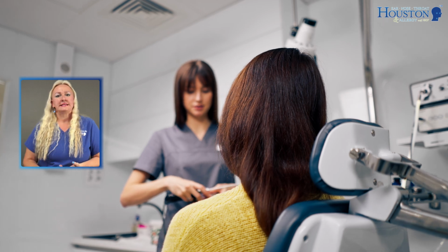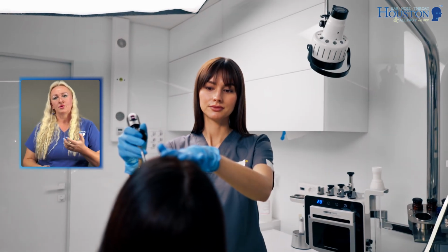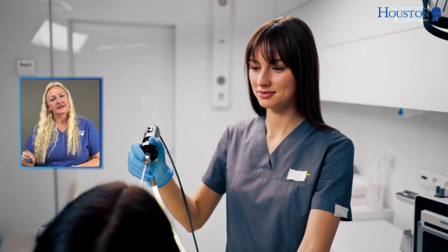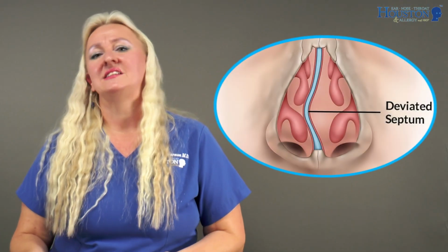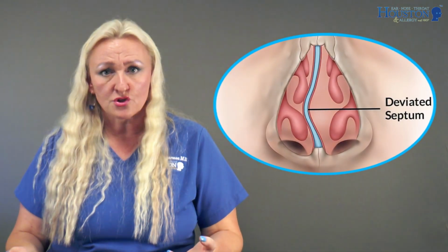While you are sitting in the exam chair and the screen is facing both you and me, I will place this very thin camera tip in your nose and we'll start seeing some of the structures in your nose. Again, if medications are not working for you, there must be a reason and we will identify it together. We will look at, for example, do you have a deviated septum, the wall in the middle of the nose that's not straight? Do you have very swollen structures called turbinates that are lying on the bottom of the nose? Do you have thick mucus that's colored, indicating some chronic infections? Some patients can have polyps, which is basically skin in the nose that's so inflamed it keeps on growing and filling your nose. Some patients can have tumors as well, especially patients that have, let's say, chronic bleeding.